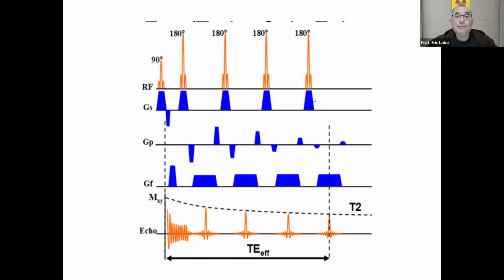Now compare that, and I'm not going to talk about the stuff going on underneath right now, to this one, which gets shorter and shorter and shorter. That's the phase encoding gradient. That is literally the slope changing on the phase encoding gradient, putting you into a different line of K-space. So it's still the same K-space. That's why these aren't changing. It's representing one slice, but different lines within that K-space.